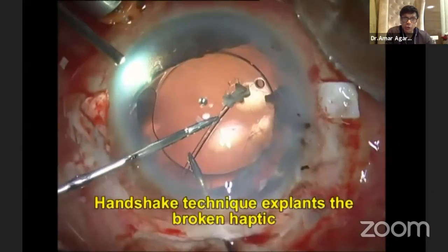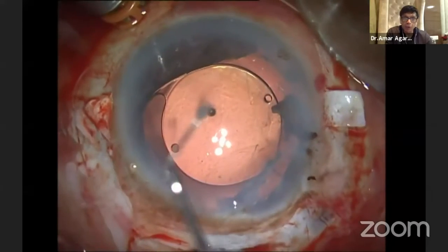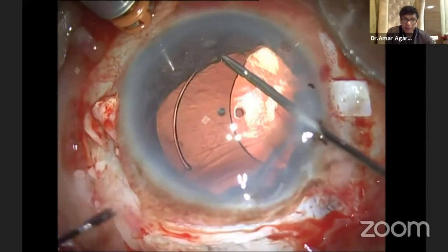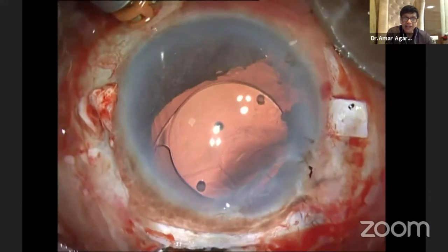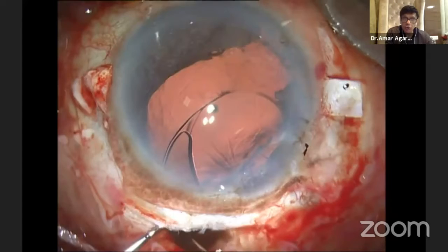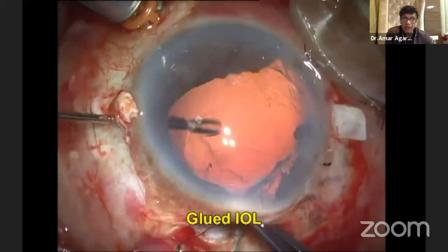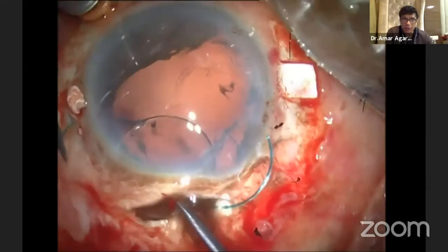Now I use the handshake technique — two glued IOL forceps like a handshake — and explant the broken haptic before it goes down. I still have the remaining haptic and the optic, so again I use the handshake technique and explant the IOL. I've removed that IOL. Now I go in with the glued IOL technique. I already have a large incision, so I might as well use it like a non-foldable IOL.